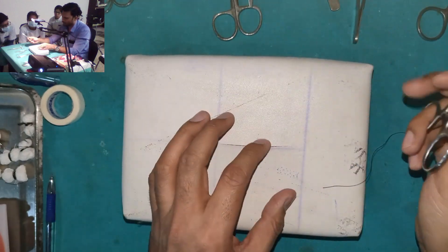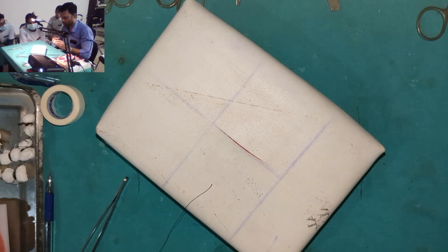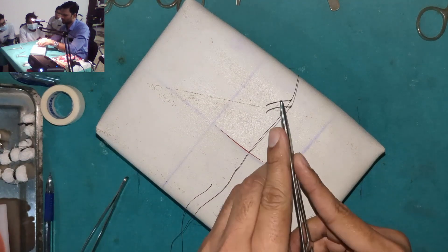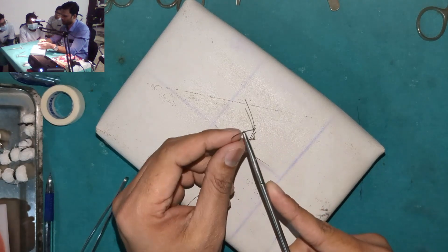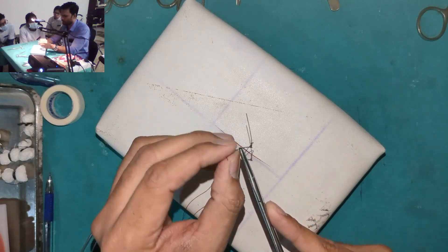Like this. So we have the incision. Now there is one disadvantage of holding it at one third the distance from the eye or two third distance from the eye. If the tissue is very stiff, fibrous, when you go to take a bite, it might get bent.